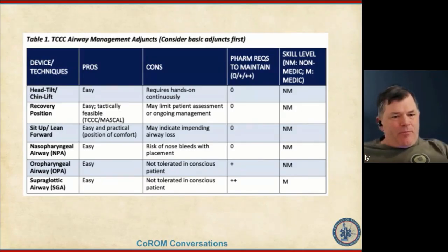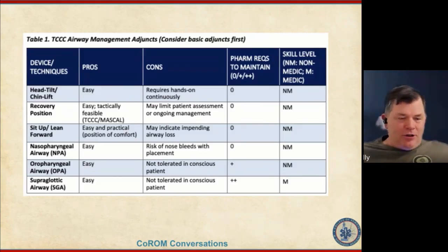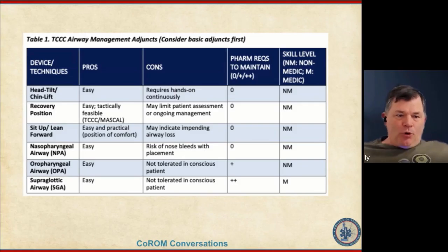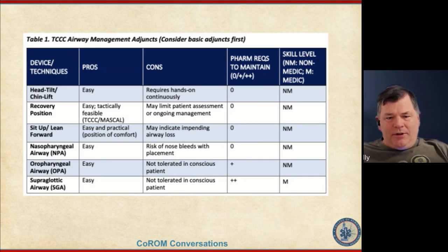Yeah. Good. So NPAs, OPAs are easy enough. NPA, there's risk of nosebleeds. Notice that there's nothing stating there's risk of going through the cribriform plate into the brain. So that is long since gone. You can put an NPA into somebody with a basal skull fracture. Oropharyngeal is not tolerated in most conscious patients. Bill Metz stated that some can, and same with supraglottic.